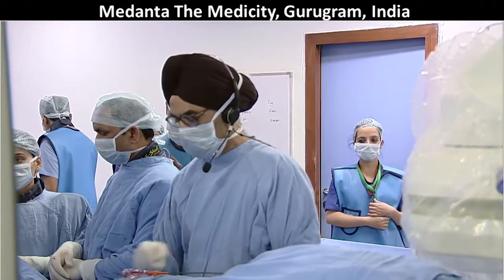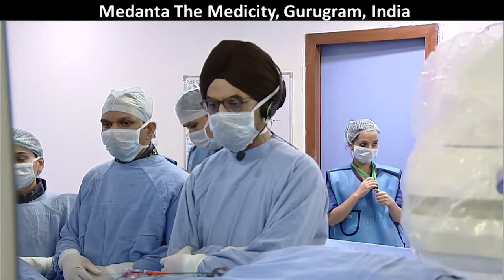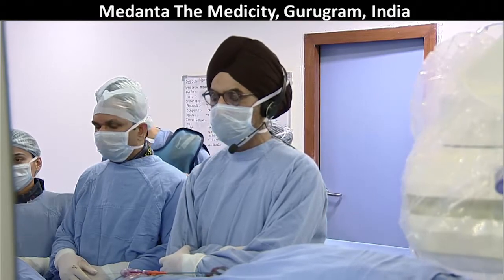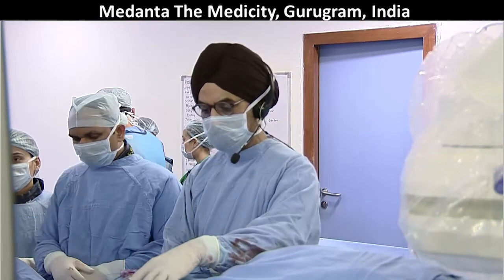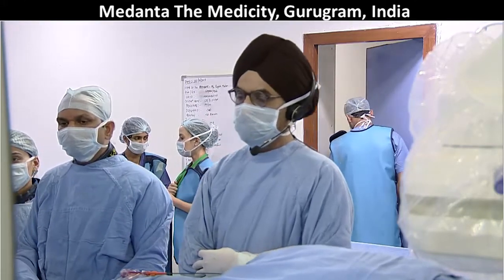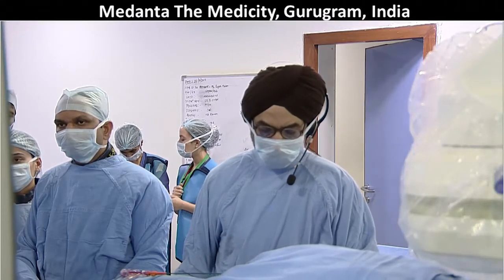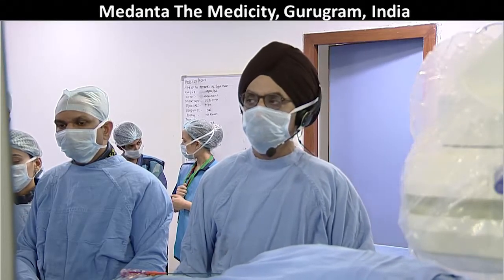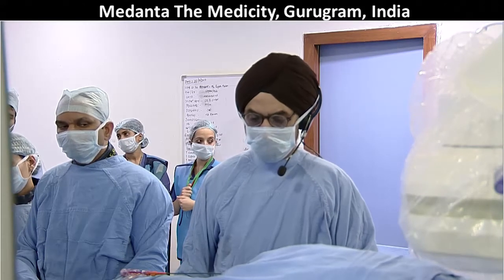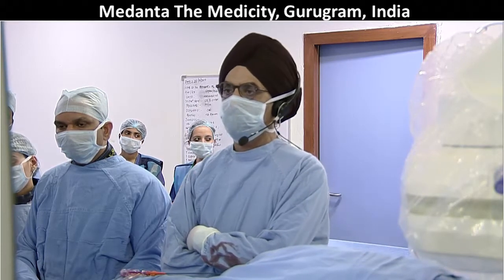Okay, so I think what I'm hearing is that most operators would favor treating the ostial LAD, and the technique is probably provisional since the ostium looks pretty decent. I just have some comments about the functional significance of the ostial LAD and whether the sizes are matched. I think maybe even the IVUS or FFR assessment of the ostial LAD lesion may be warranted after treating the distal LAD, to give you more grounds to stent the left main here.